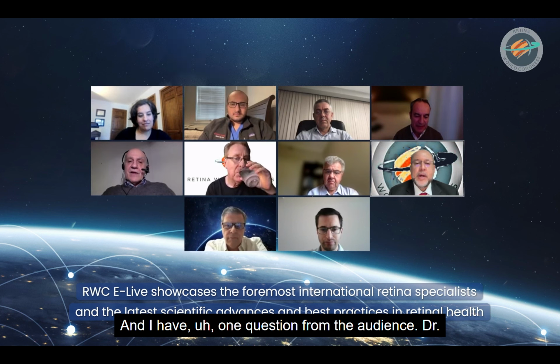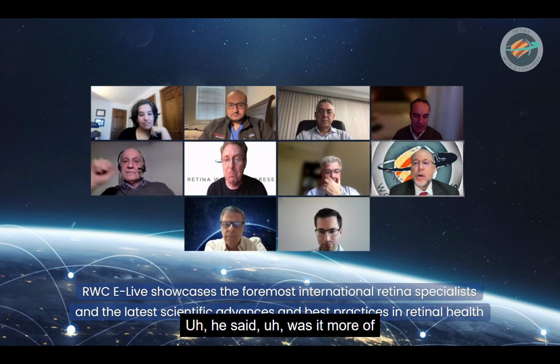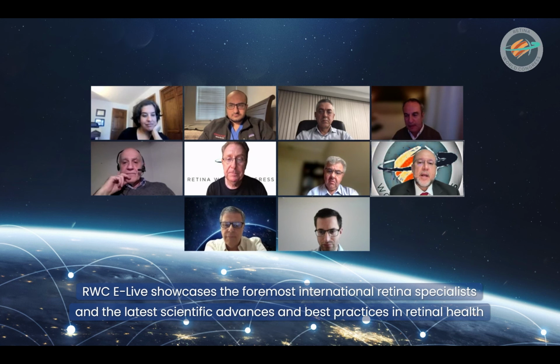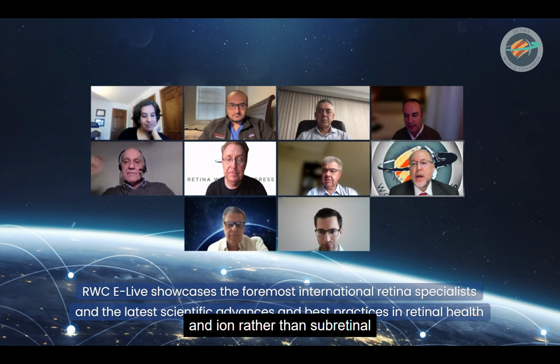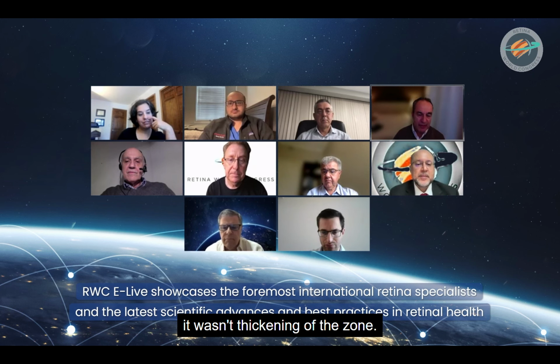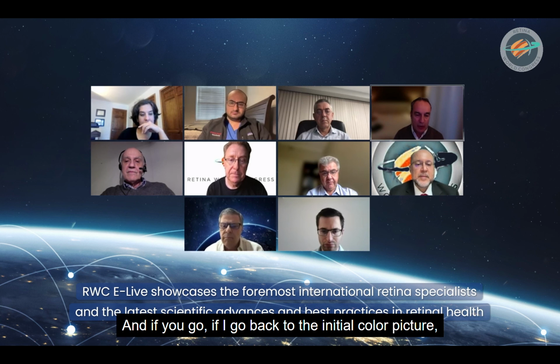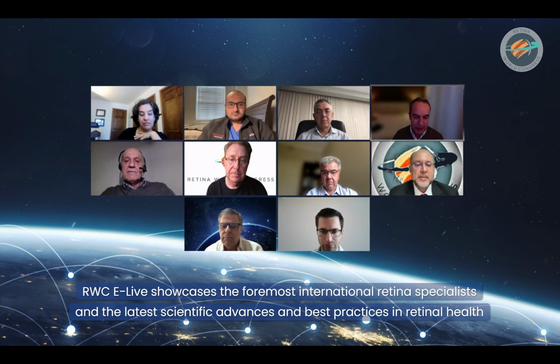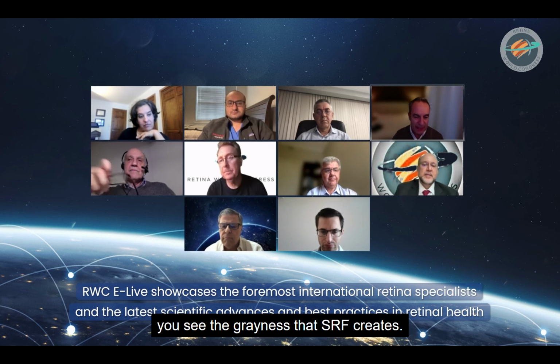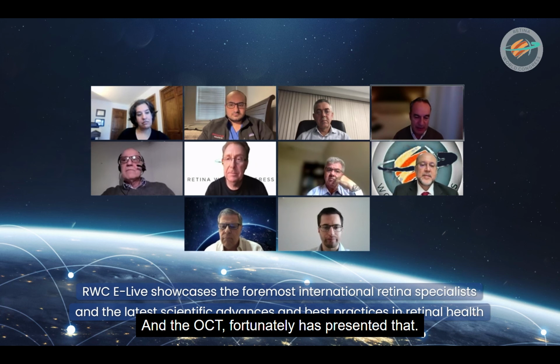And I have one question from the audience, Dr. Pandey. He said, was it more of ellipsoid zone thickening and rarefaction rather than subretinal fluid? You agree with that? No, it wasn't thickening of the zone. It was SRF. It's obvious in the OCT that it's SRF. If I go back to the initial color picture, you see the grayness that SRF creates. It wasn't thickness, it was SRF. And the OCT, fortunately, has presented that.